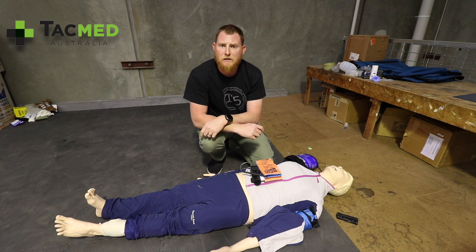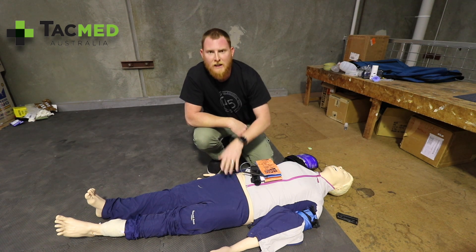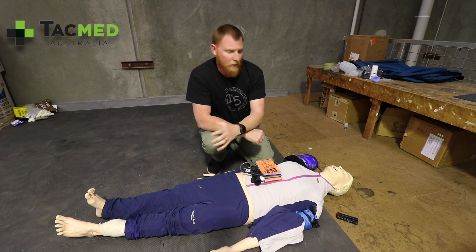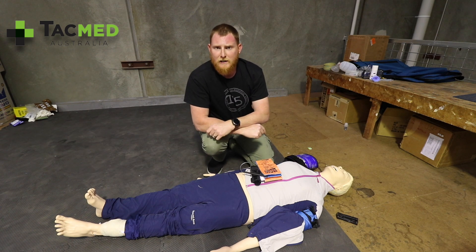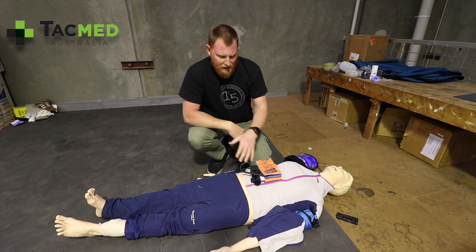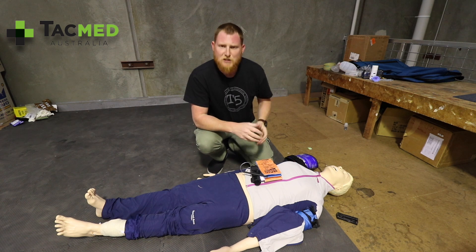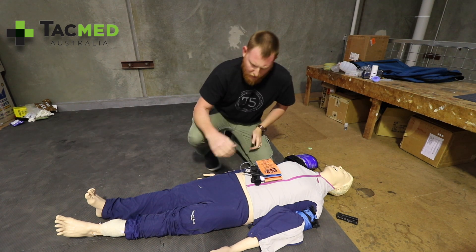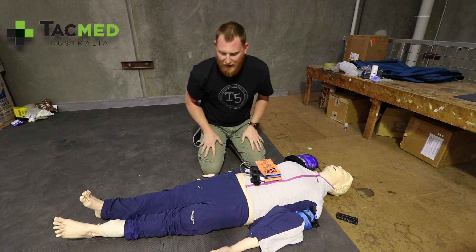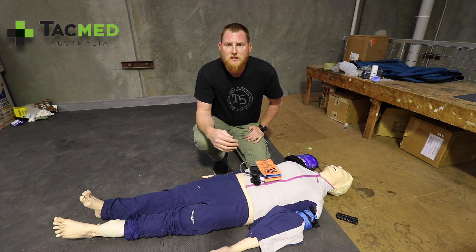When we look at any major trauma, and especially blunt force trauma, we have a high susceptibility to pelvic fractures, and it's a hemorrhage — they're bleeding into their pelvis. We may not be able to see it like we can with external bleeding, but it certainly can be life-threatening if we don't treat it.